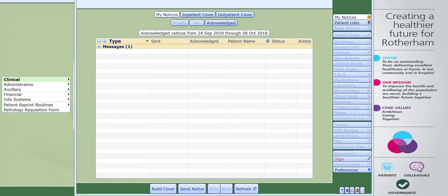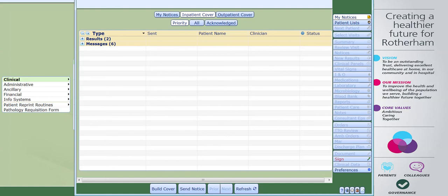The next thing that you need to do is click onto inpatient cover. You will then be shown any results or messages that you have. Clicking onto the plus next to the results will show further details for the results.